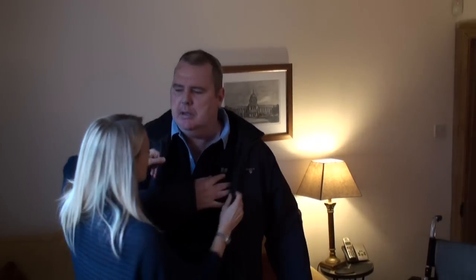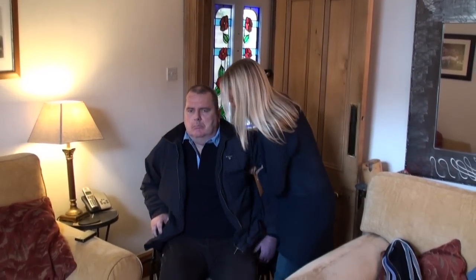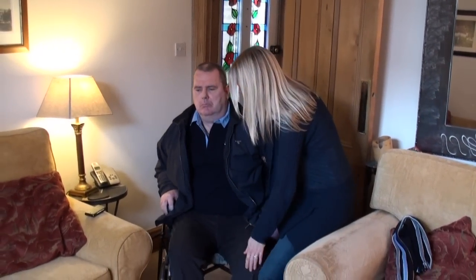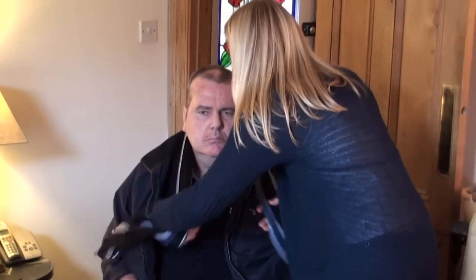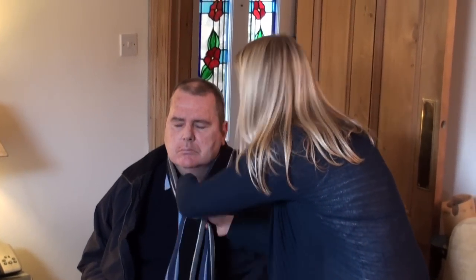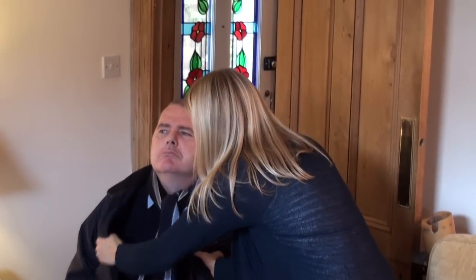Before setting off, ensure you have adequate clothing. Ensure the person is comfortable in their chair with their lower back right against the back of the seat. Check the pressure cushion is in place and the right way up if you have one, especially for long journeys. If someone is sat in a wheelchair for long periods of time, they are more likely to get cold much quicker.